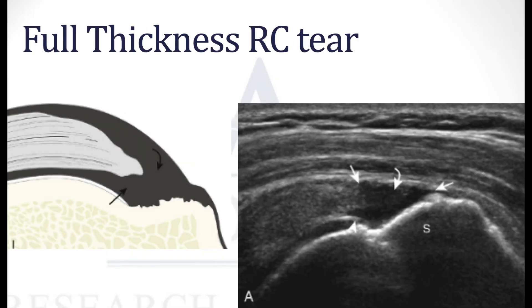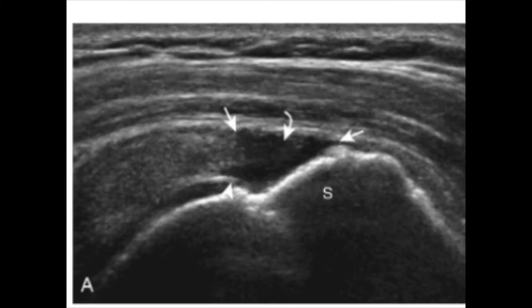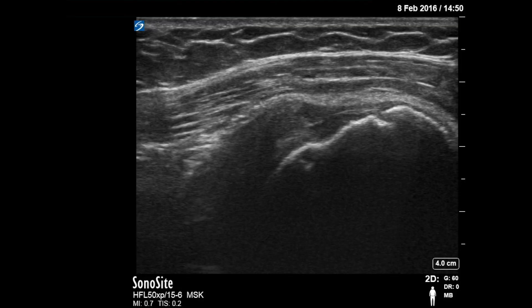What about a higher grade, more problematic full-thickness rotator cuff tear? We could clearly see here how the tendon is detached and slightly retracted. Let's look at another image of that — clearly we can see the disruption of normal architecture of the fibrillar pattern of the tendon.